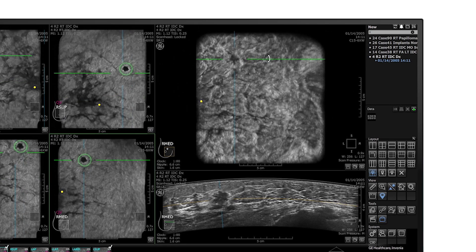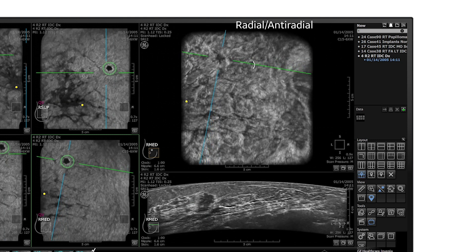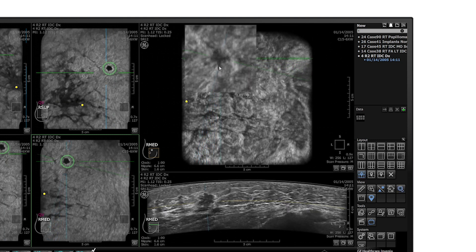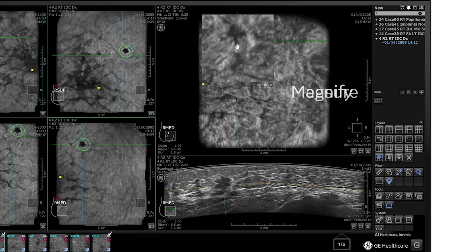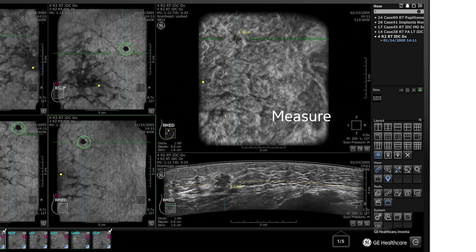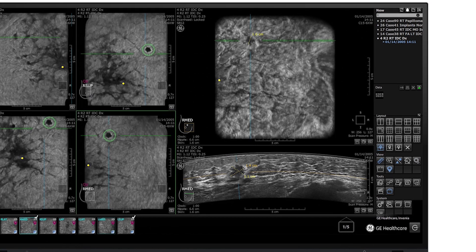With the ability to adjust the radial and anti-radial views, place a marker, zoom and measure, Invenia A-Bus viewer tool users can seamlessly evaluate areas of interest.